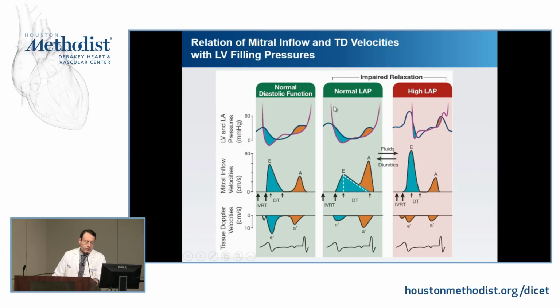If the ventricular pressure is slow to decline, you end up with a higher minimal LV pressure. As a result, with the mean LA pressure that is not elevated, that gradient, that space of the curve, is a smaller area. And then you have a lower E, a longer time for that E to dissipate, a longer time for the velocity to rise, a longer IVRT. Now comes the time of atrial contraction. The atrium has not emptied much blood. The atrium follows the Starling mechanism, if you would, and now contracts more forcefully, gives you that larger A wave.